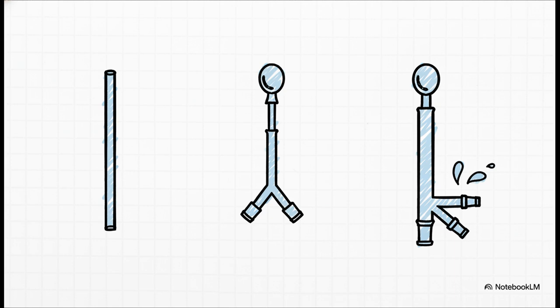So one channel drains the urine, and the second lets you inflate that anchor balloon. And finally, the triple lumen catheters. These are the heavy-duty options, used a lot post-operatively, allowing you to run a continuous stream of bladder irrigation to clear out blood clots and debris.